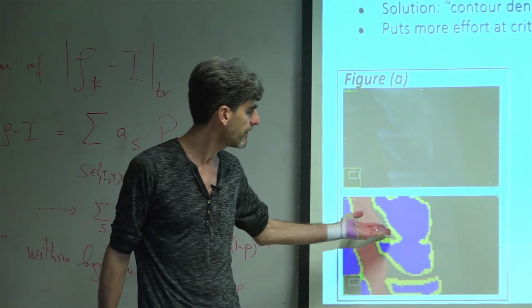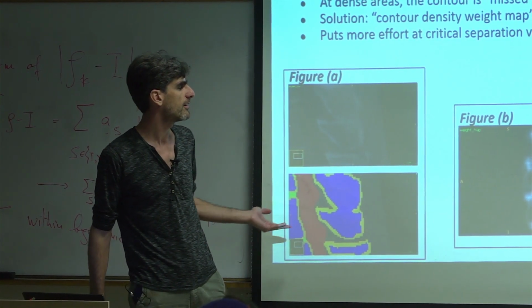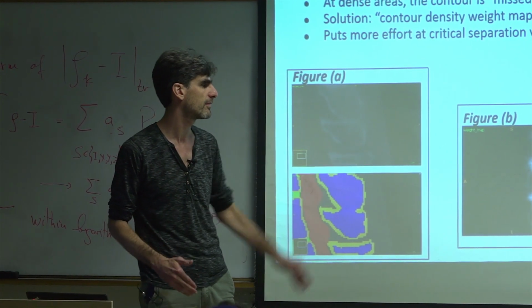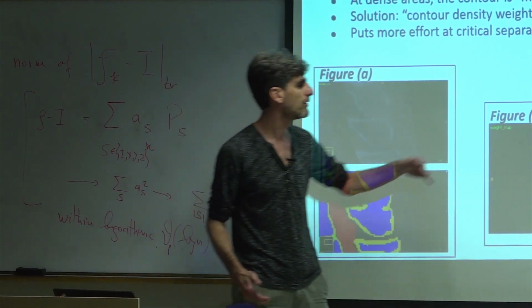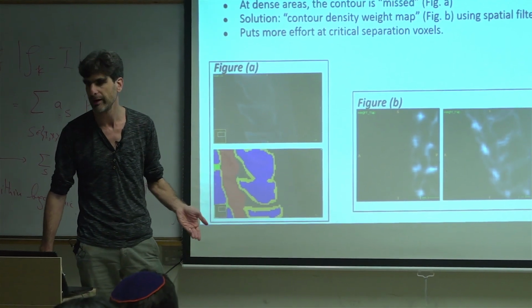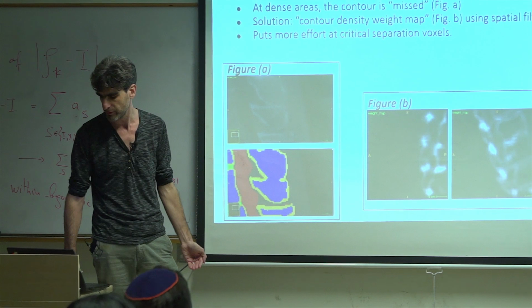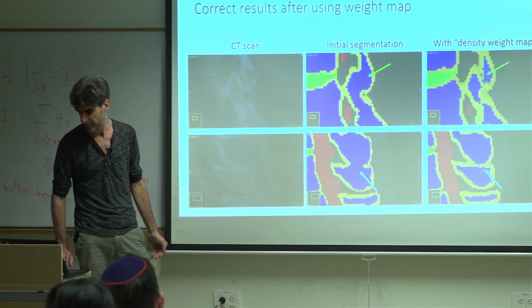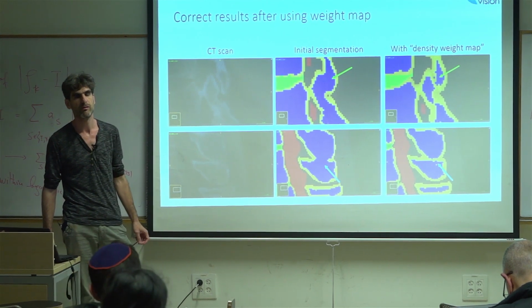Okay, so here again we saw that the network wasn't finding the border areas well enough. And what we did is implement a special weighting function. We applied some filters, a second derivative type of filter in different directions, sort of a classical algorithm. But we don't use this to detect the borders themselves. All we do is use this to mark suspected boundary areas and give those more weight while training the network. So we tell the network, okay, pay attention to these areas. We think maybe they're a border. We don't force it or constrain it. We just use it to improve the training, and lo and behold, this does what you would expect it to do, and we get the bone cortex, the bone borders, with more emphasis.